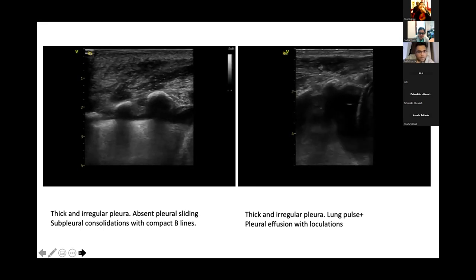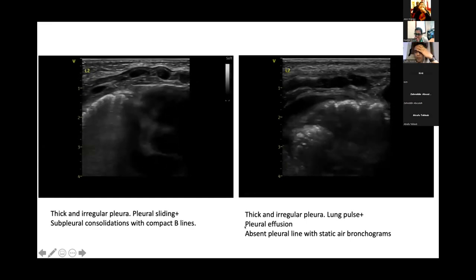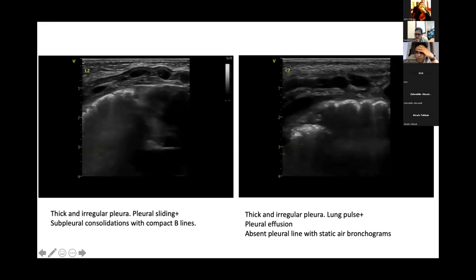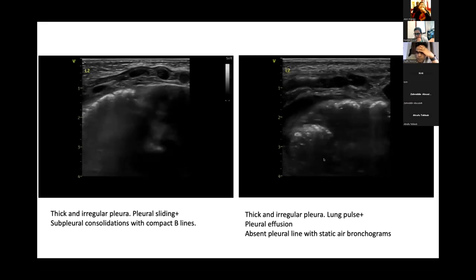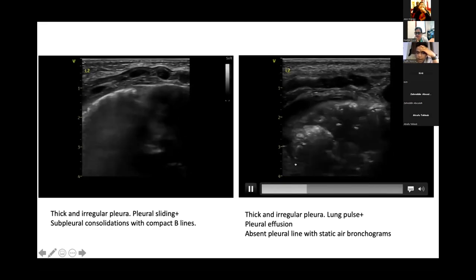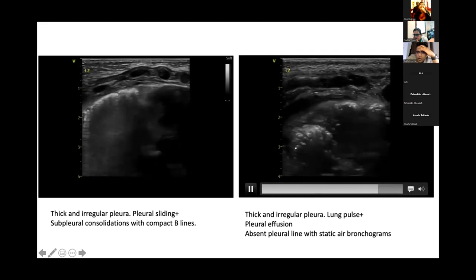I had a bit of a problem understanding what we were seeing. Was it this one? Yeah, I think L2 probably. Of course, you've got the heart taking up a big place in L1, but the L2, I think. I'm unsure about exactly where we are and what the thing on the left is. You think it's the lung? I think that is the lung, Nadia.